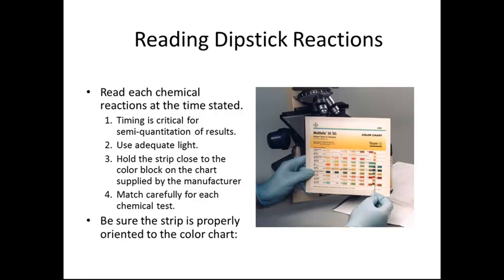You would not want to hold this upright like shown here, but you would want this parallel with your surface so these pads do not bleed together. So the timing is really critical, and you want to make sure that you hold the pads so you can read them rather quickly. You want to line them up, but make sure you don't touch the actual bottle with the reagent strips.